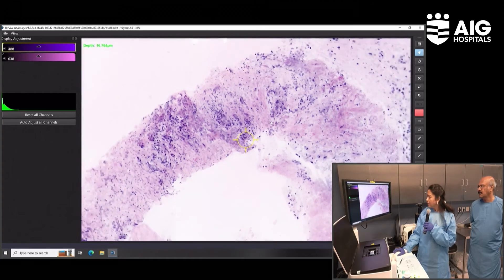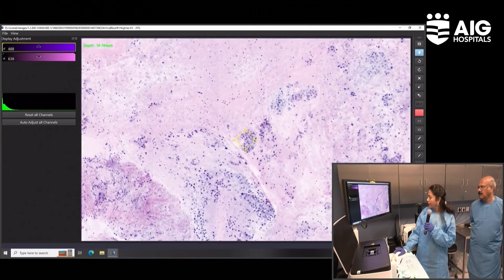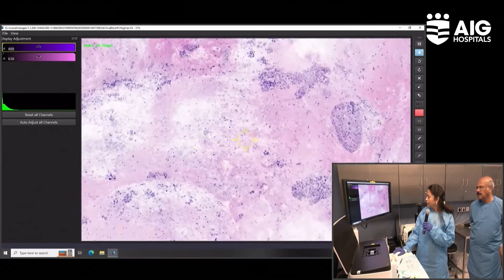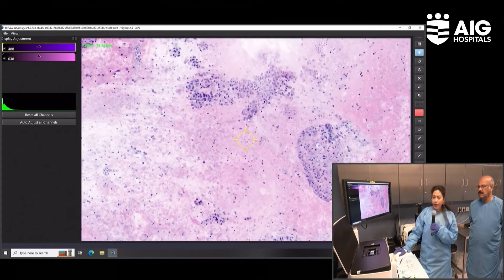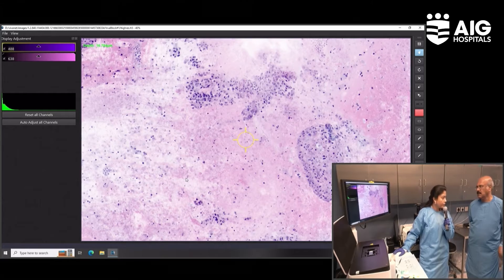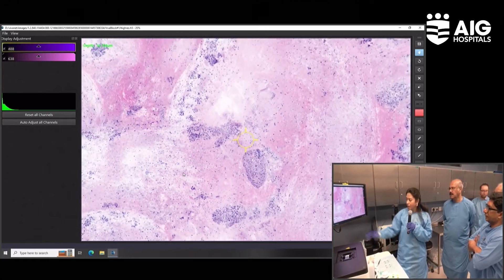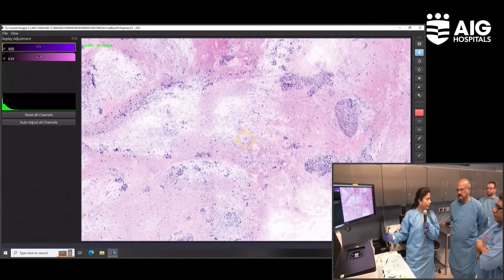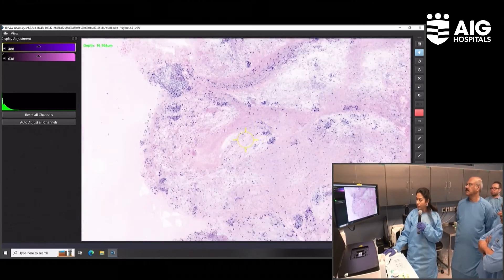We can see the entire tissue — it's a good core with good architecture. In FNAs we call it positive when searching for discohesive cells and bare nuclei. But sometimes when cellularity is limited, we balance between cellularity and cellular features of the limited cluster. But having tissue like this, I am more confident to give a diagnosis because it is like routine histology and you can see the stromal tissue clearly.